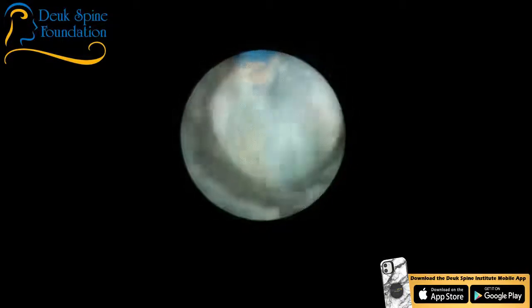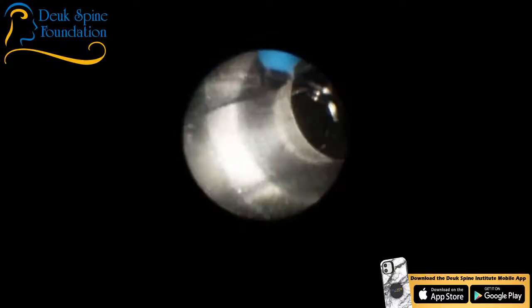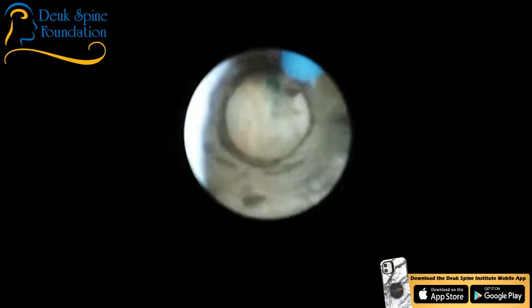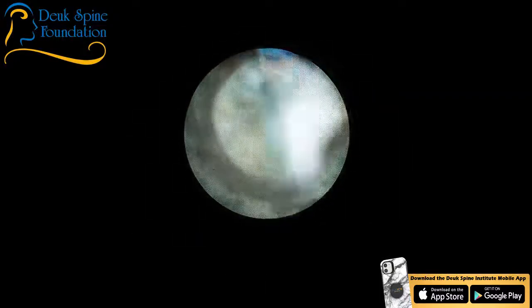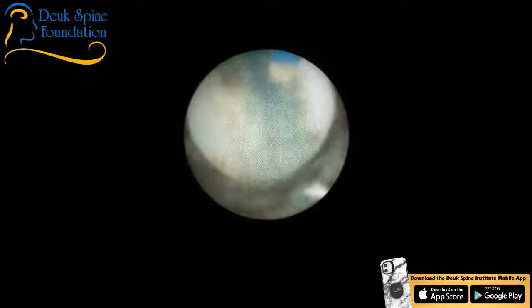You have to know. The only way you know is by investigating. All right. Oh, there's another piece. So, what's this patient's number one complaint? There's a piece of herniation right there. Anybody know? Is it her neck pain, her headaches, her arm? Can we look at the history there, please? What's her chief complaint?